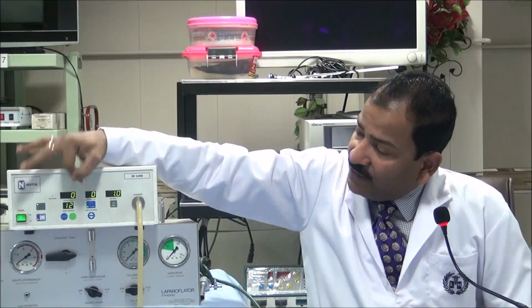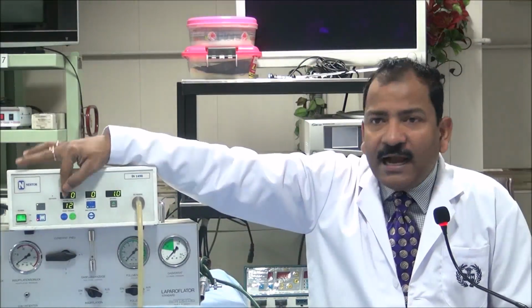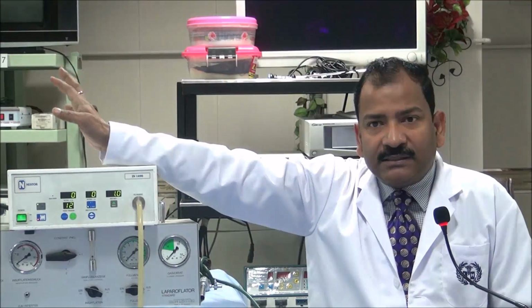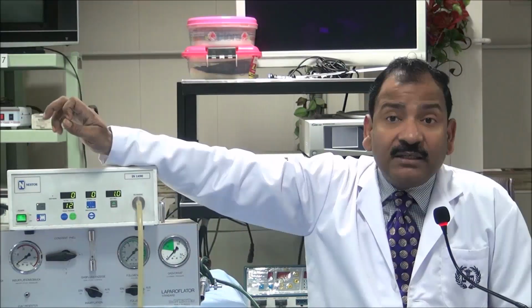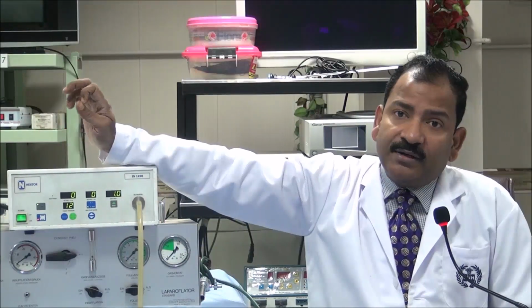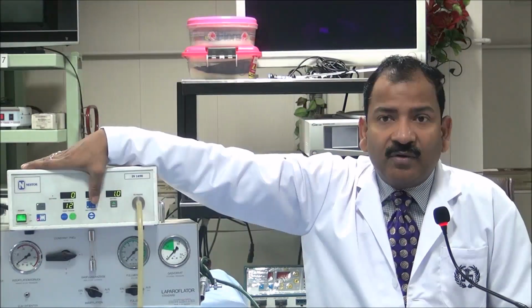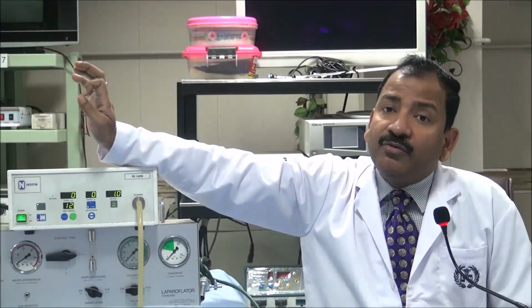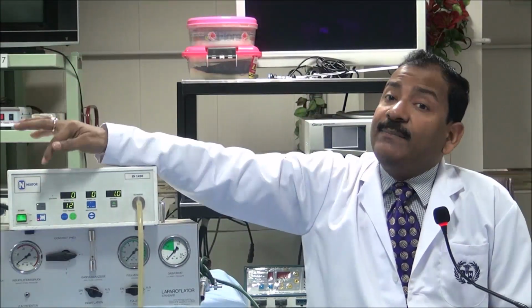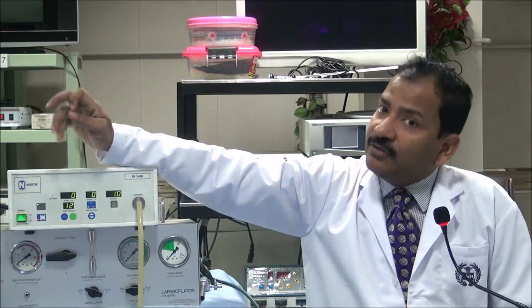You know what I was telling you? If there is no flow, 0 here, and the pressure is high, that means you are in the wrong place. Either the tip of the Veress is touching the bowel, or your Veress is blocked, or it is kinked somewhere. But if it is still going 0, 1, 0, 1, 0, 1, that means restricted flow. And if the minimum of the 5 readings is within the limit of 3, 4 as you are saying, then there is no problem, you should wait. Because this high pressure with the Veress needle will always show, due to resistance.